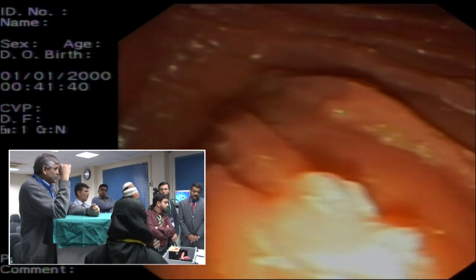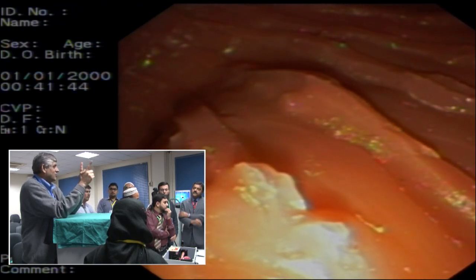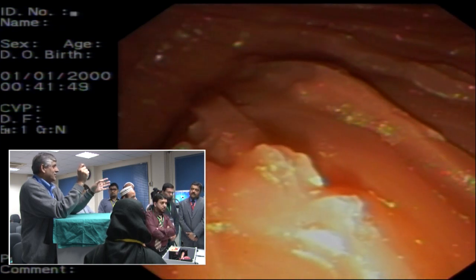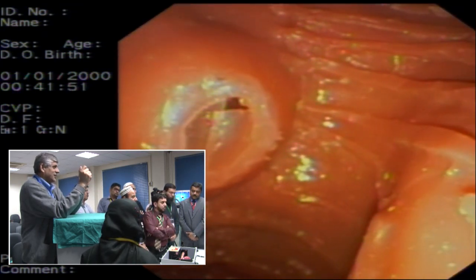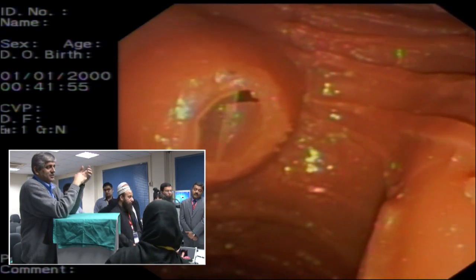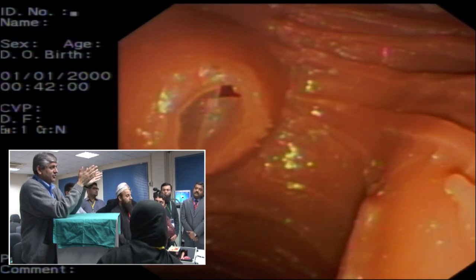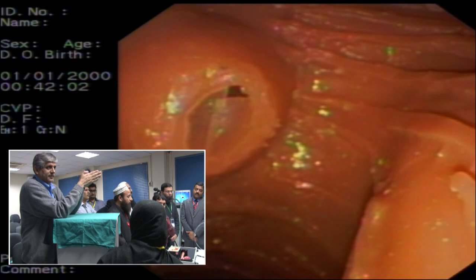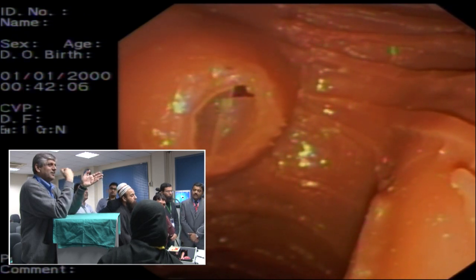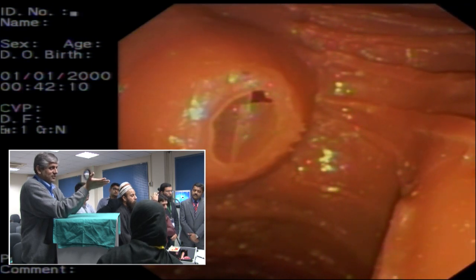But you and your tech have to have an understanding about what advancing is, what pushing the wire means, or injecting, how much do they inject. All this has to be very clear. दूसरा, if you're using a wire withdrawal, stent placement thing, you need to have a very coordinated thing, and you can't operate on your own. But if you don't understand the language of each other, then you can have disaster.